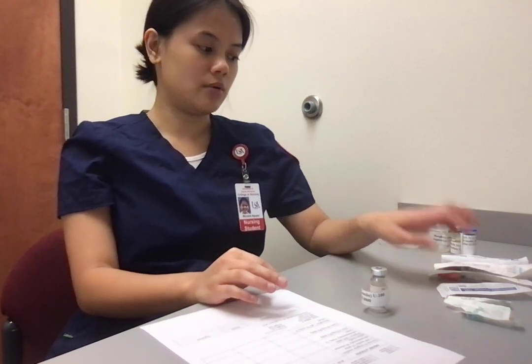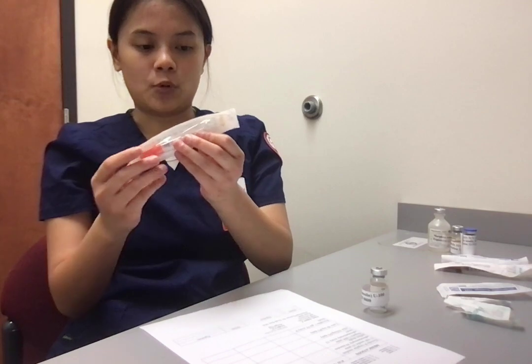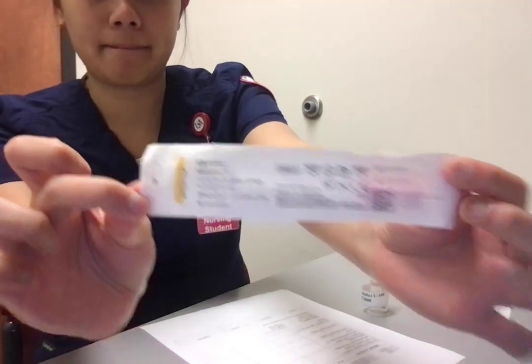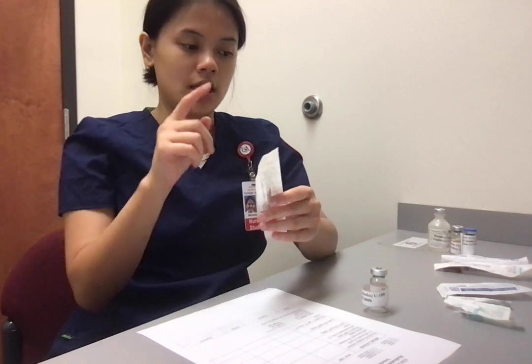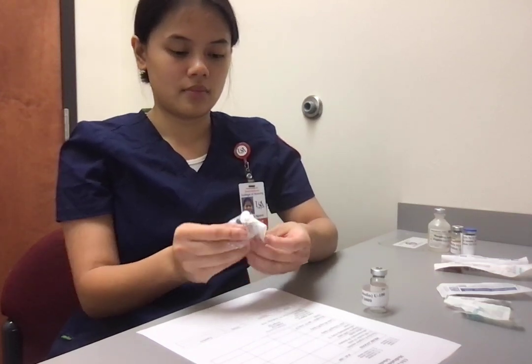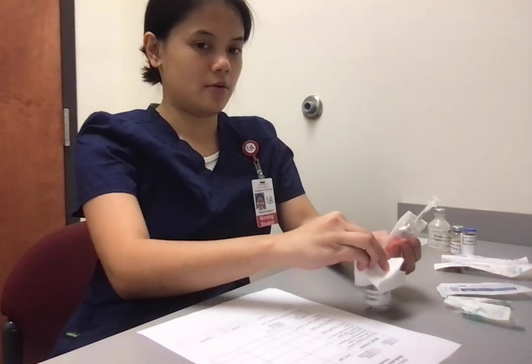Next is right route. I'm going to be giving it subcutaneously, and I'm going to be choosing the 29 gauge insulin syringe. Right dose 10 units. And I'm going to be getting 10 units. I'm going to wipe my bottle.